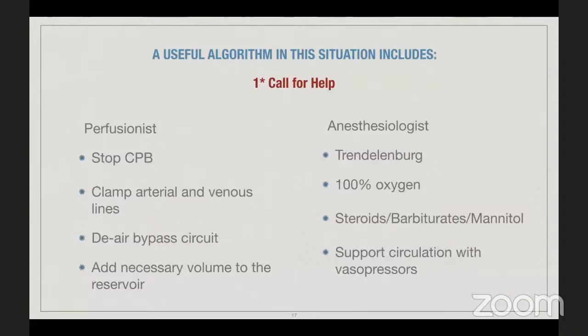Maybe when you forward the flow, it creates bubbles. Your voice is interrupting. I was saying that maybe when the perfusion is forwarded fast, then it creates bubbles, so we have to forward slowly. Maybe, but this is easy to detect because this is one of the standard safety measures that we do after connecting the line. Another source.